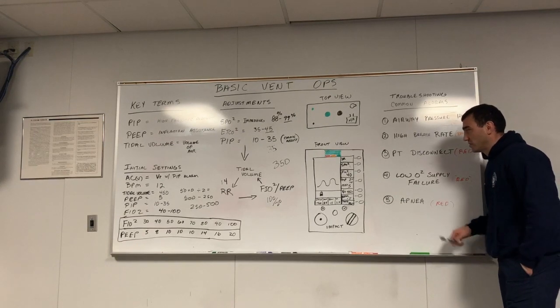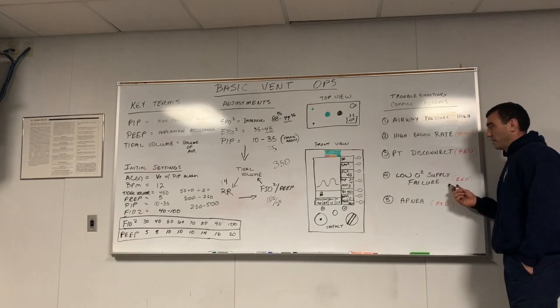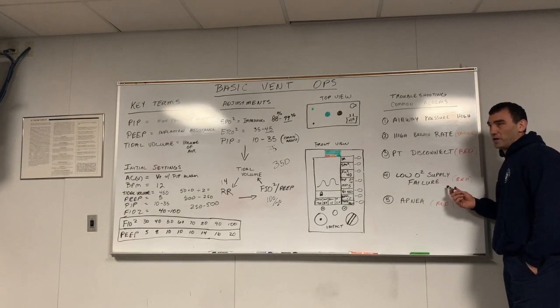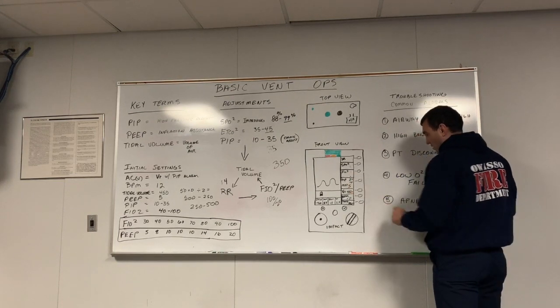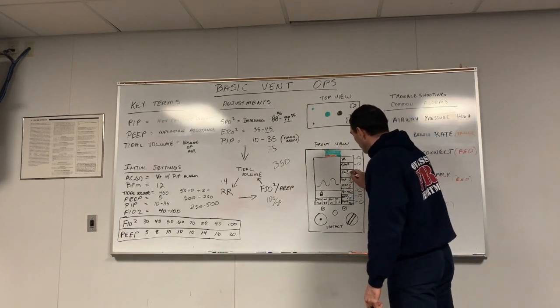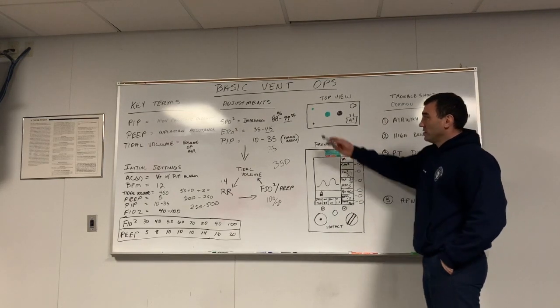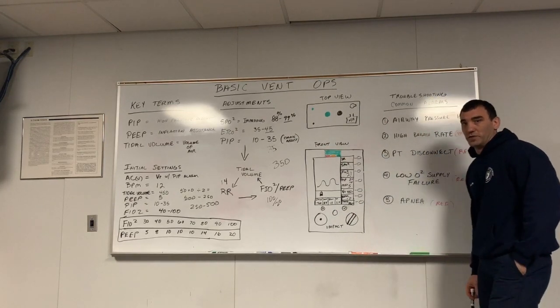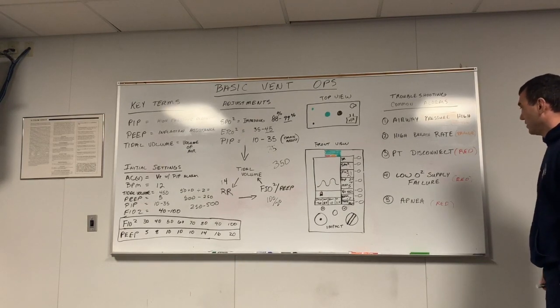As soon as it's connected, make sure there's actually oxygen in the bottle. If this happens, you connect your supply, you realize I'm out of oxygen, you're still okay. Just turn this back down to 21 and give the patient room air. So go to 21%, give them room air, check your SpO2. You can still deliver ventilations with that. You just only do it at room air. You can no longer give them extra oxygen.